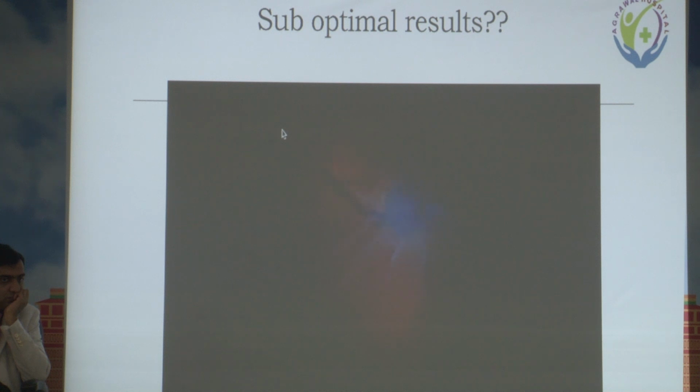So you have to use the blue stain, trypan blue, repeated stain with trypan blue. You have to keep it a little longer, for around 30 to 40 seconds to get adequate stain. As you can see, the whole membrane was removed.